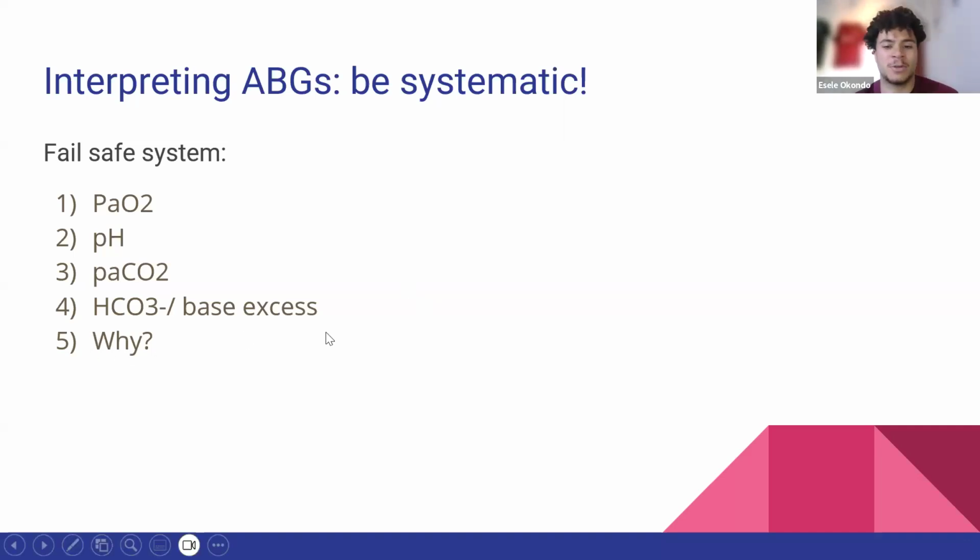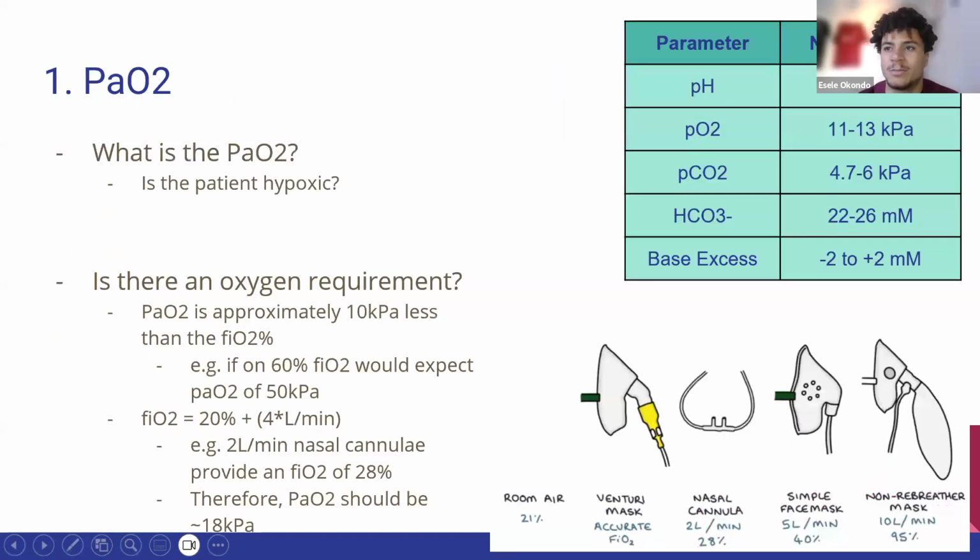It's always important to interpret these results within the clinical context, within the vignette that you're given. And you want to make sure that those things line up, basically. And the information you're given in your vignette will likely lean you towards what's going on even before you've read the ABG. So take all those parts of information that you can before you even get started in interpretation.